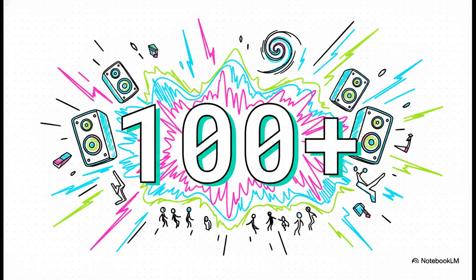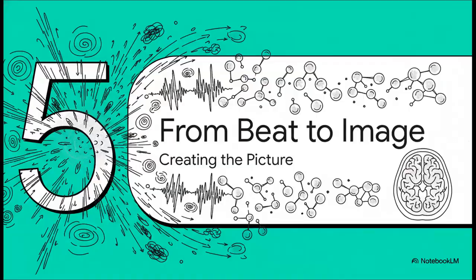But then, you can take it to the next level. We're talking echoplanar imaging, or as we're calling it, rave mode. This is where the DJ goes all out with those lighting effects, the gradients, and just switches them back and forth at an unbelievable speed. We're talking fast enough to create over 100 echoes in just a couple of seconds. It's literally like a strobe light hitting the dance floor, freezing everyone in a perfect sync over and over again, almost instantly.